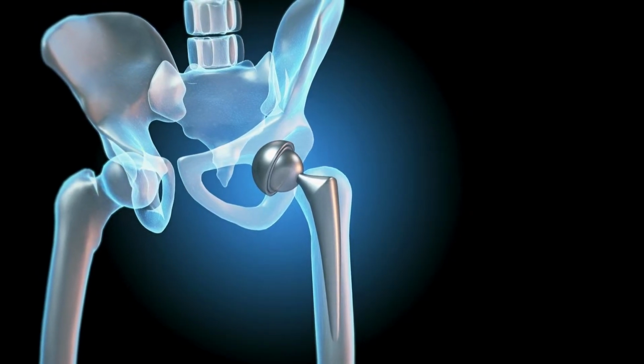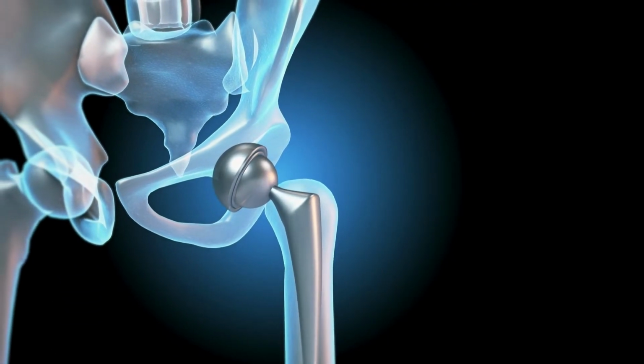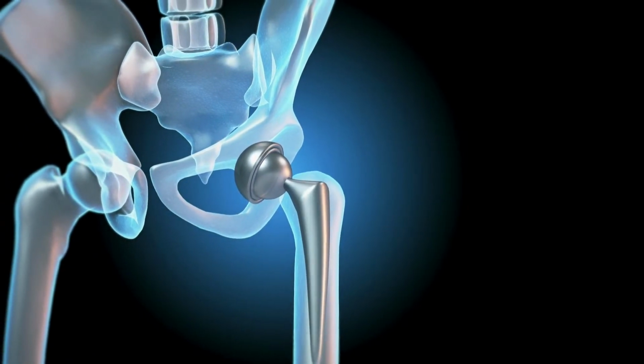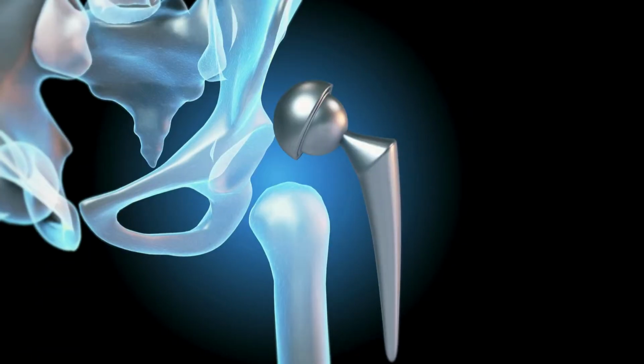Total hip replacement, also known as hip arthroplasty, is a surgical procedure where a damaged hip joint is replaced with artificial components. It's typically recommended for patients with severe hip pain and dysfunction.